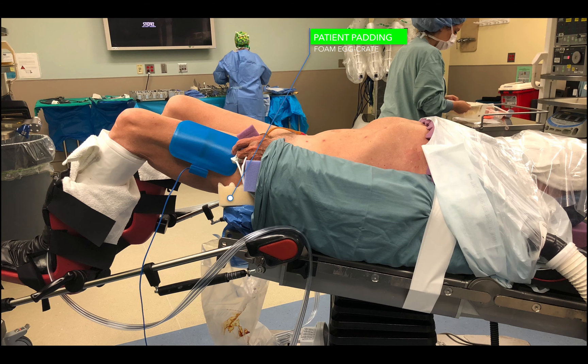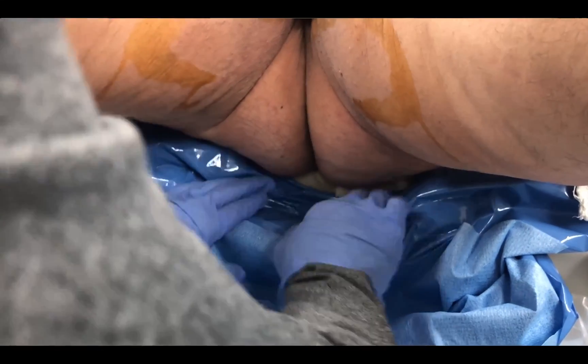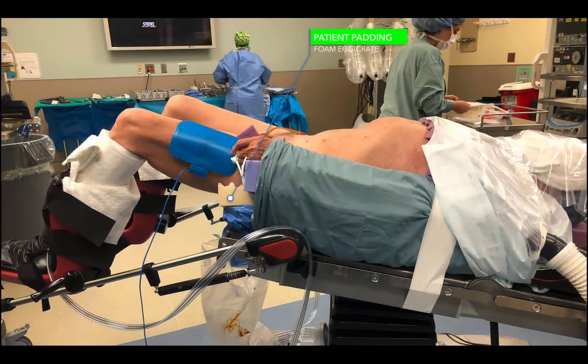Patients are positioned in the low lithotomy position. Patients in my operating room are placed on a nice thick egg crate with a tuck sheet that sits on top of the egg crate. The first thing I do is pull the patient down low enough so that the coccyx and ischial spines are at the lowest part of the bed, and I make sure that the buttocks and perineum are easily exposed.